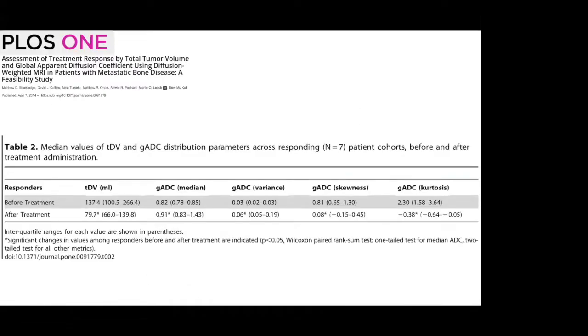But I also wanted to mention, before I go to the next application, that similar to myeloma, there are now a lot of initiatives to standardize whole body MRI in bone metastatic disease. And the MET-RADS, like the MY-RADS, has been published recently. I think, even more so than in prostate cancer, it might have a role in breast cancer, because there you don't have all the radiopharmaceuticals that might be helpful, and you just rely on the bone scan and your CT, which we all know is not very helpful.